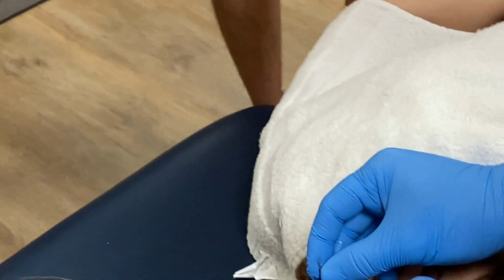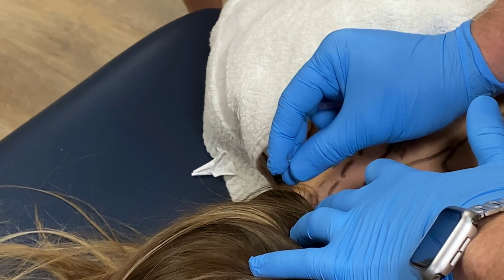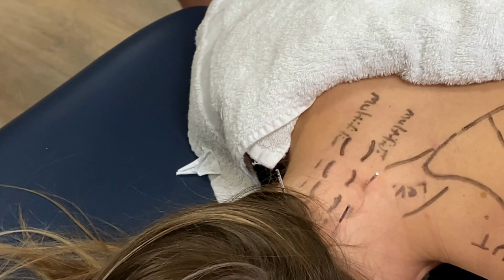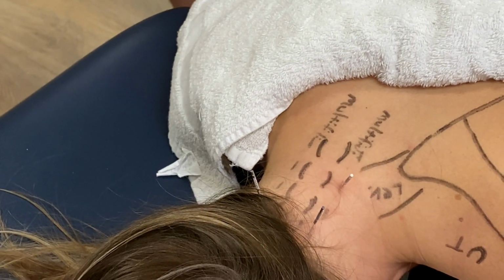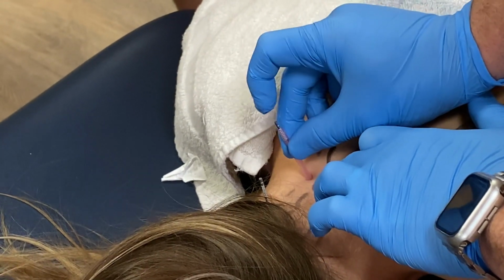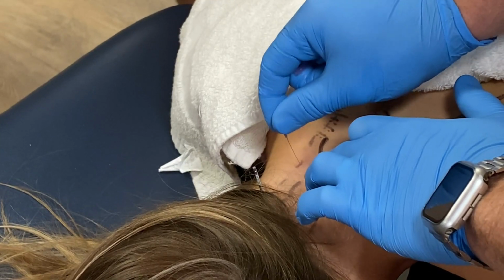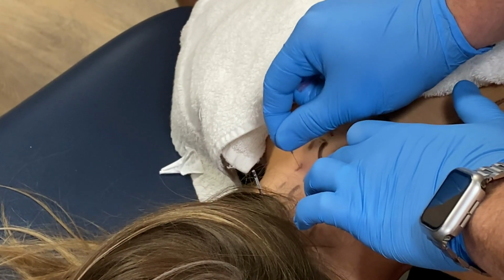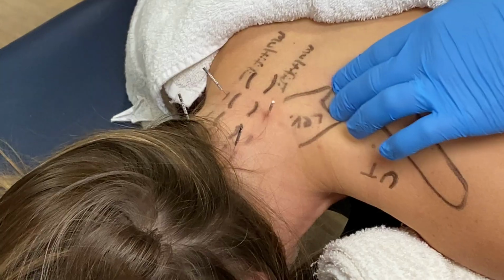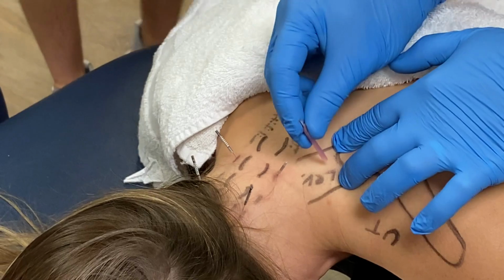Fingers on the edge of the spinous process, little tap. This is vertical, slightly medial. There's your lamina there. Still fingers on the edge of the spinous process, finger width out, little tap. This is vertical, slightly medial. Lamina there too. Superior medial scapular border, so you can either pinch or you can do this depressing technique.